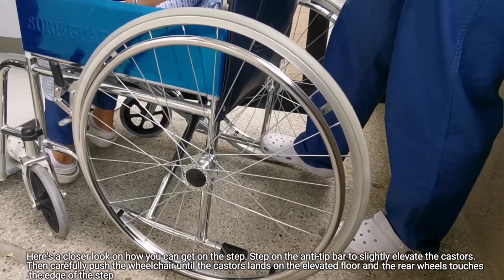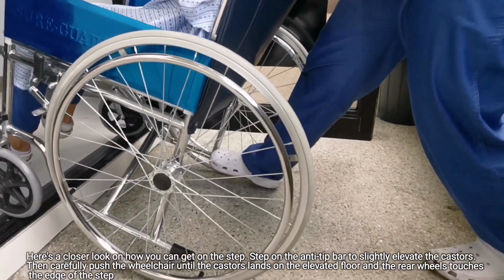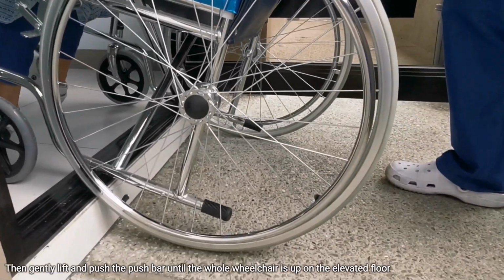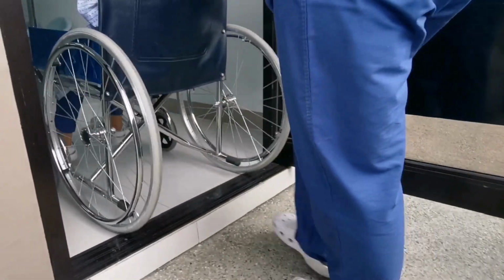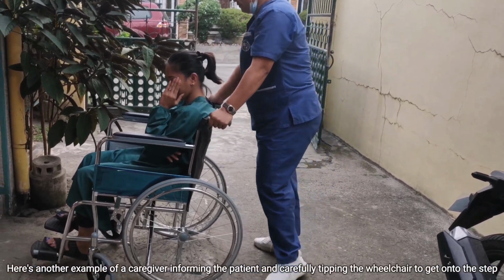Here's a closer look on how you can get on the step. Step on the anti-tip bar to slightly elevate the castors, then carefully push the wheelchair until the castors land on the elevated floor and the rear wheel touches the edge of the step. Then gently lift and push the push bar until the whole wheelchair is up on the elevated floor. Here's another example of a caregiver informing the patient and carefully tipping the wheelchair to get onto the step.